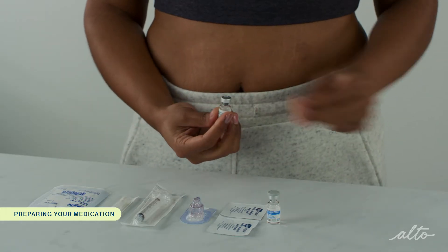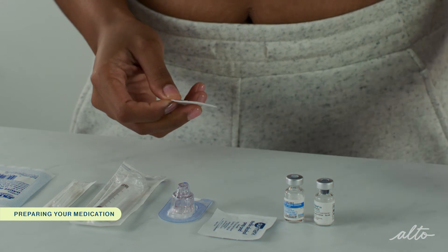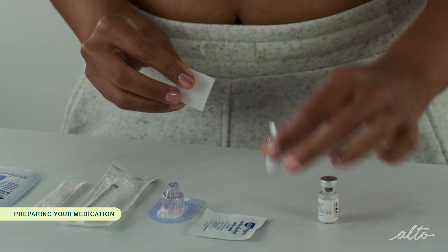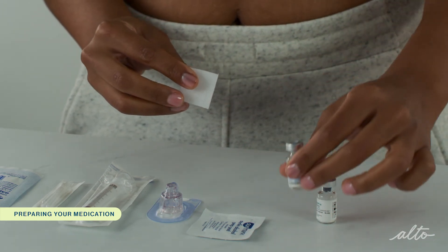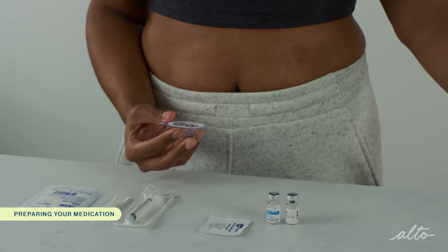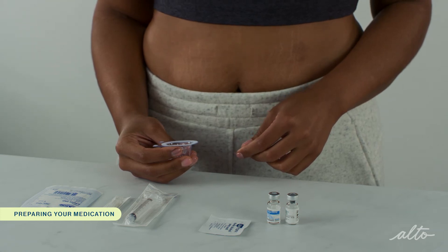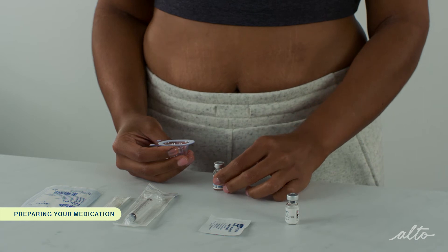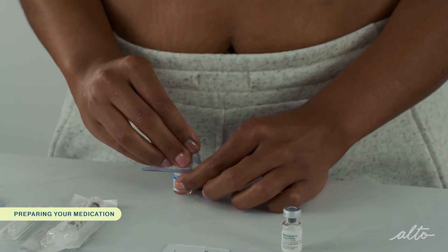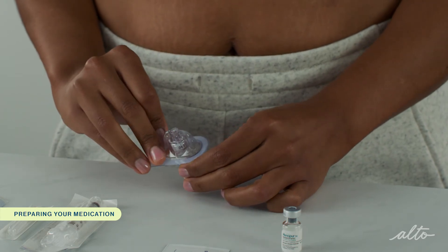To begin, flip off the plastic caps on the Menopur powdered vial and vial of diluent and wipe the tops with an alcohol pad. Peel off the seal on the Q-cap blister pack, but do not take the Q-cap out of the blister pack yet. Leaving the Q-cap in the blister pack prevents contamination. Next, place the vial of diluent on a flat surface and hold the sides of the Q-cap blister pack and push the spiked end of the Q-cap into the rubber stopper of the vial until it stops and snaps into place. Remove the blister pack, but do not touch the connector end of the Q-cap.